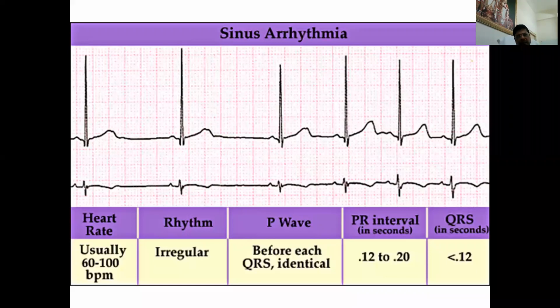We have many dipoles being created in the heart as the action potential is spreading, and those dipoles have a magnitude and direction, and what is recorded by the electrode is the average dipole at any given point of time. All that we have seen. Then we looked at the steps in which the ECG has to be read.